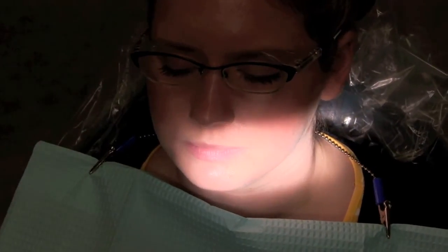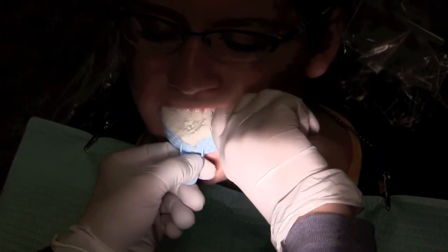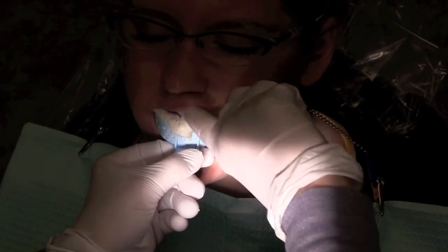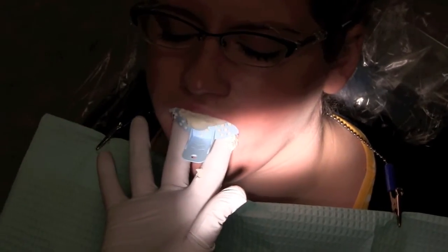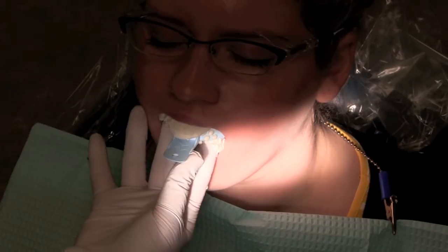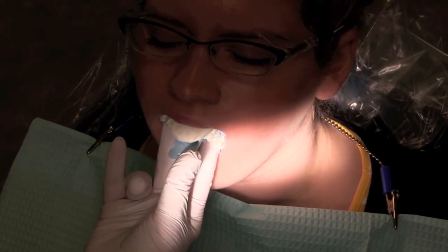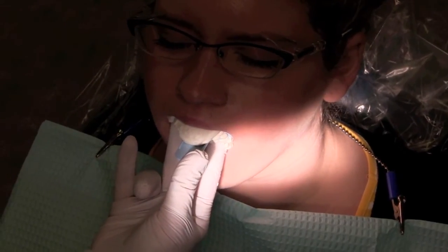Katie, I'm going to be taking the upper impression now. I'm going to ask you just to relax, and I need your lips on the outside of the impression. And once again, it'll be about a minute and a half, and I'll be with you the whole time.